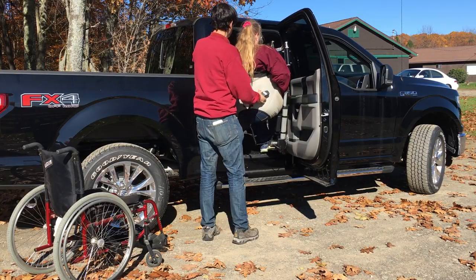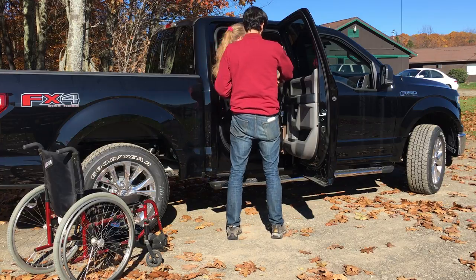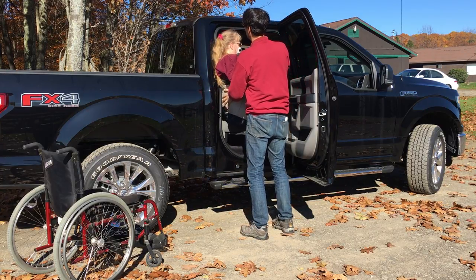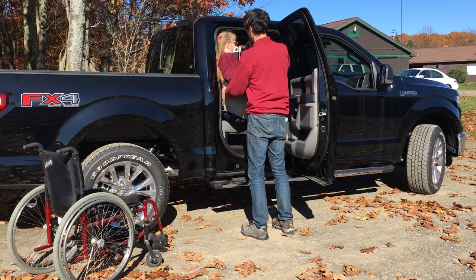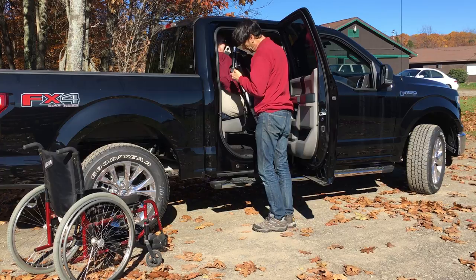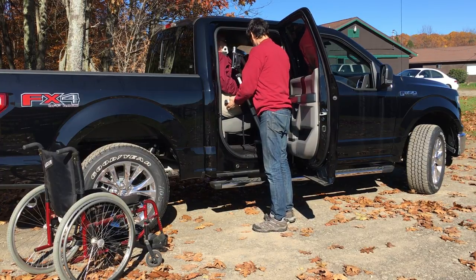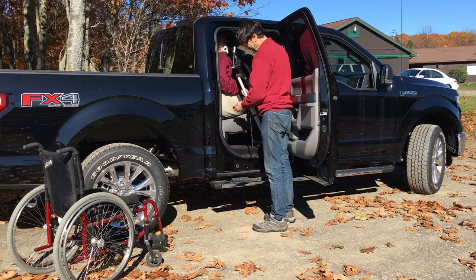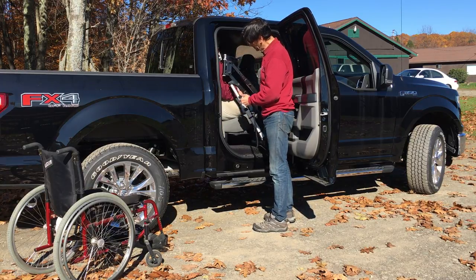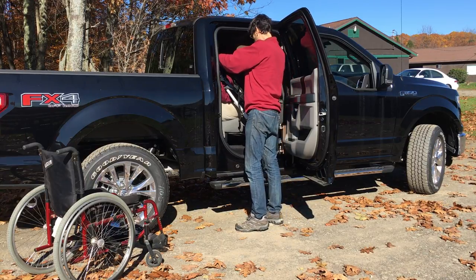Now, we recommend this application for people who are medium height or maybe a little bit taller, and small people, but we're not going to recommend this for the very largest people because of the size constraints of the door opening. In that case, you probably want to go into the front door. When we're in the right position, lower, so we take the load off here.